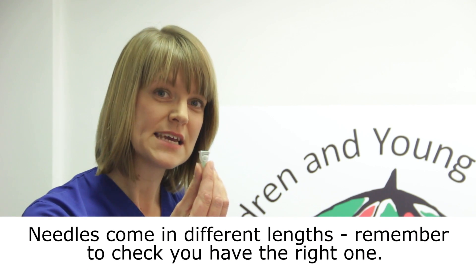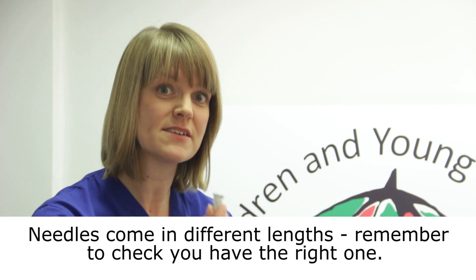The equipment you will need includes an insulin pen, your insulin, and your insulin pen needle. It's vital that you use a clean pen needle for every single injection.